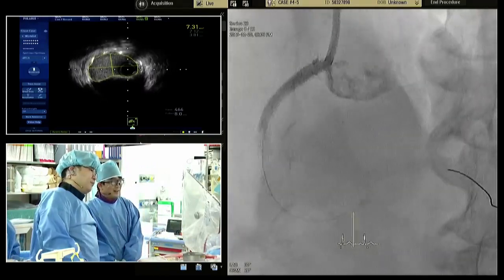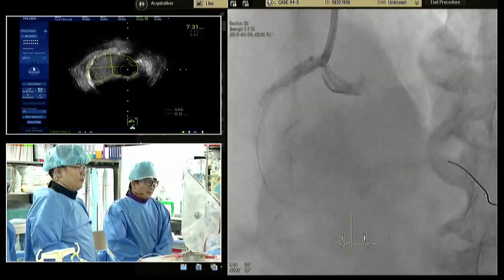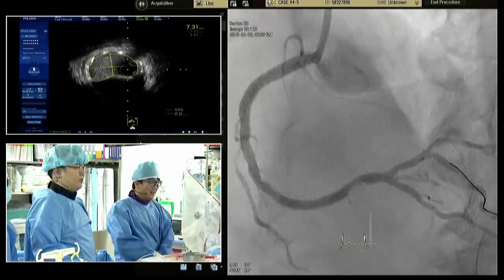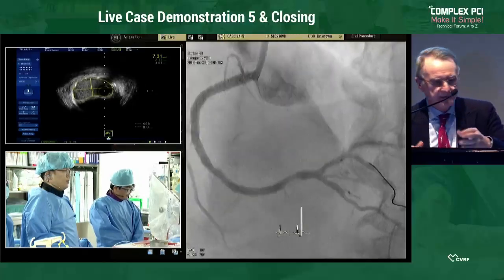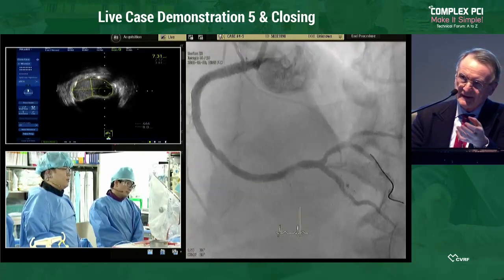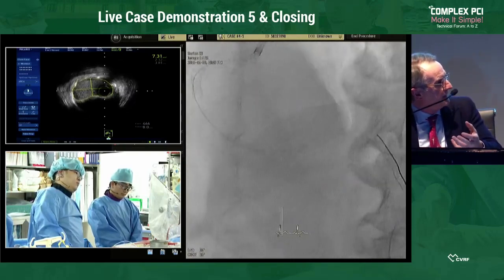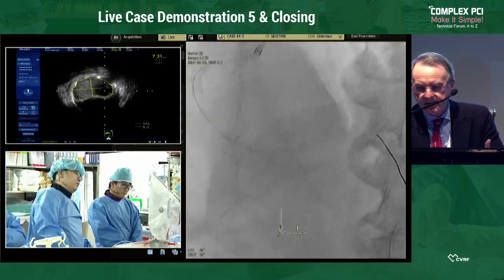Well, it's a very difficult question. Difficult, not too much difficult, right? Is it appropriate to evaluate FFR in this context? Because we know that it will still give some outflow impediment to the stent. So why not place a short stent there?